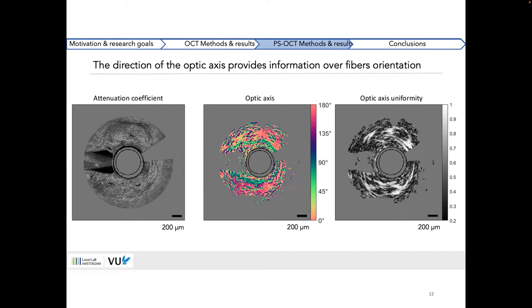And so here, 0 degrees. So I think this is the one that is now circular. The fibers are oriented like this, and green, this color, is along the fiber. So we can use that where we say, okay, only fiber directions that are more or less circumferential, plus or minus 15 degrees, we count as muscle, and the rest we ignore. So now we can segment out the muscle layer.